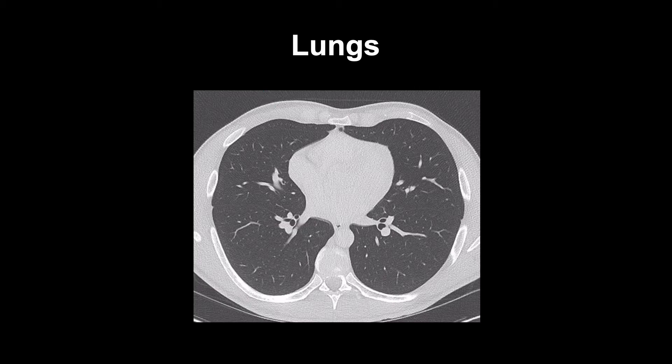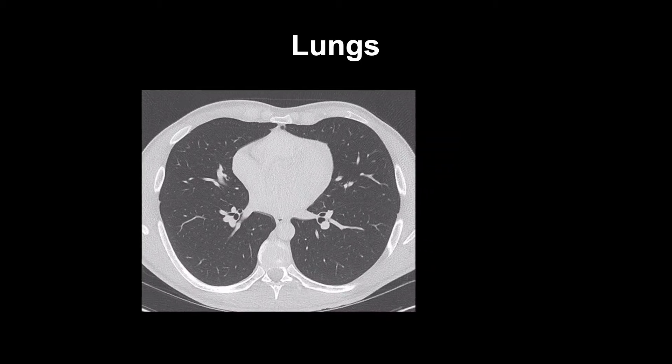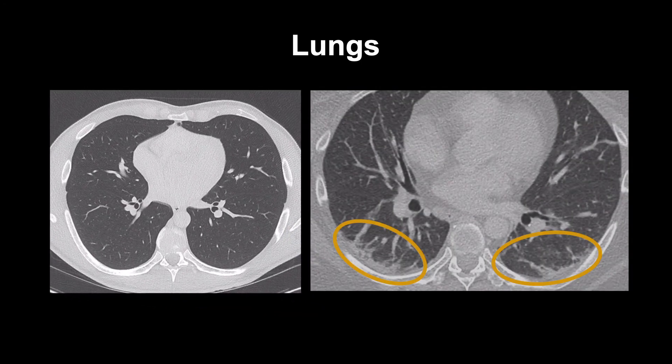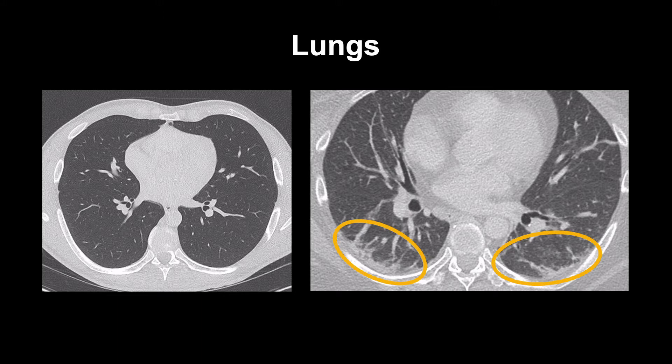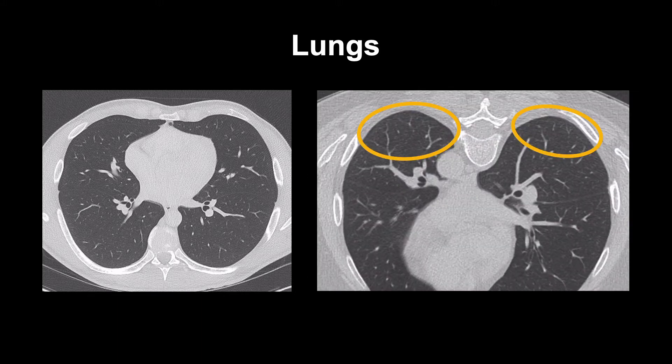The attenuation is generally homogeneous, although when the patient is lying supine, as they do in a CT scanner, the weight of the non-dependent lungs can cause a little atelectasis in the dependent lung, increasing its density and making it look whiter. If you are concerned about pathology, re-scan the patient in a prone position. If it goes away, it is simply atelectasis.